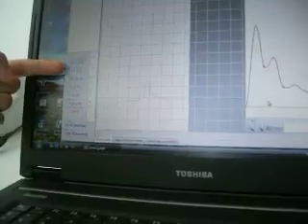Pulse velocity is one of the most important parameters obtained this way. Augmentation index is a very good predictor of cardiovascular outcomes, and central blood pressures, namely central systolic blood pressure and central pulse pressures, are very important parameters also. So, just to go back to the automatic analysis, I press this button up here. These are the automatic results. Let's see how a printout looks like.